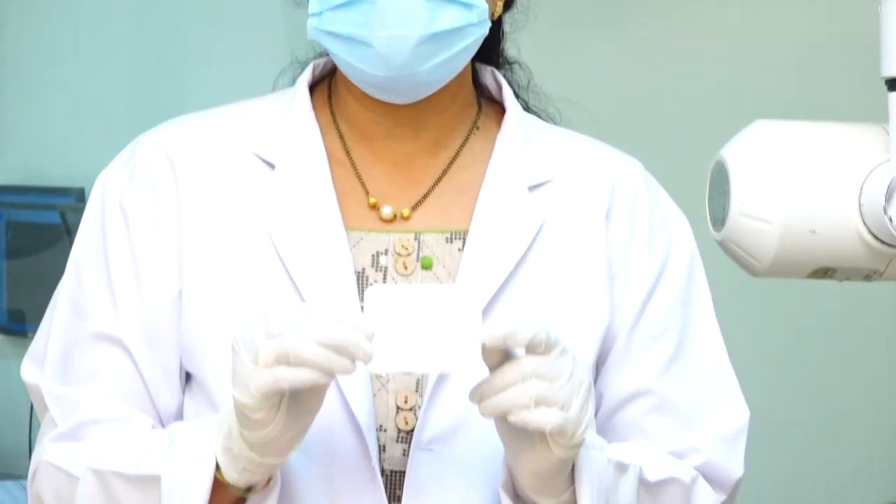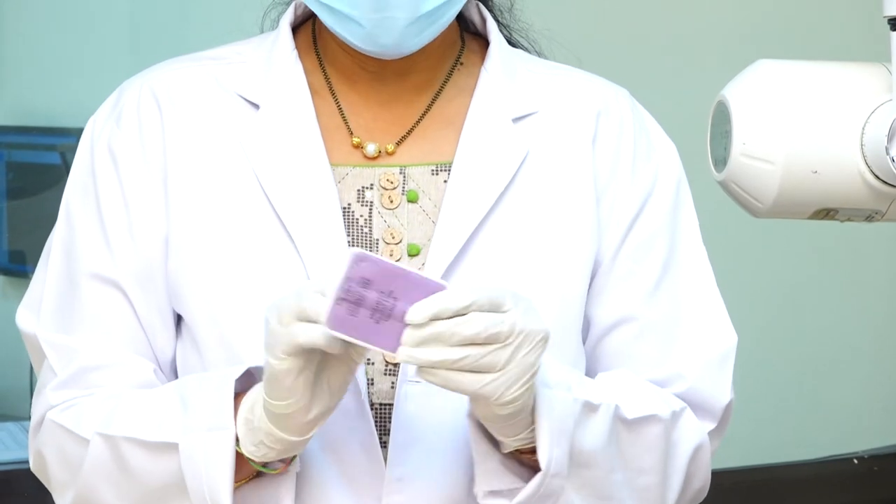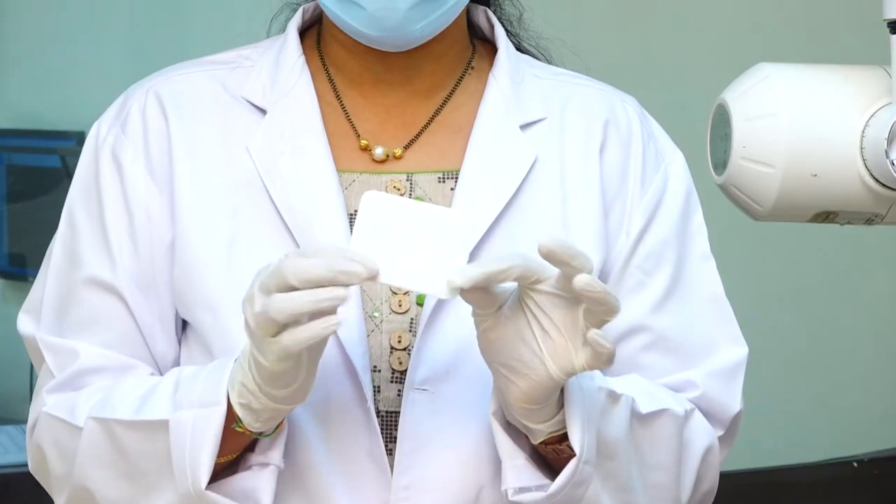Good morning. Myself Dr. Sethu Manusha from the Department of Oral Medicine and Radiology. Today I am going to give a demo on occlusal radiograph. This is the occlusal film. The size of this film is three times greater than a size two film. It has a colored surface and a white surface.